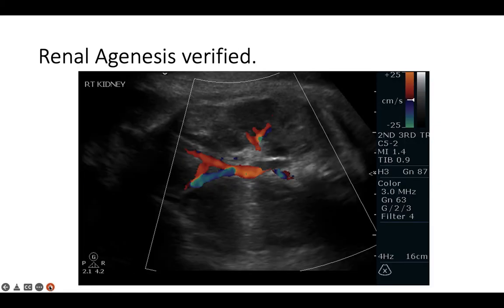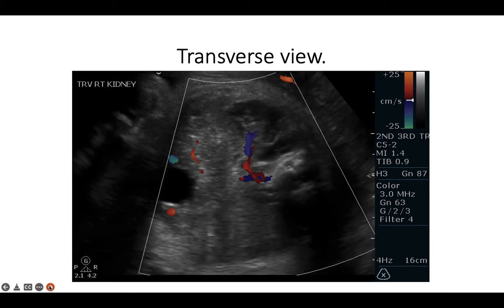Using this technique, you can see there's only one renal artery branching from the aorta in this image, raising the suspicion of renal agenesis. Here it is in transverse, but be very careful when you're in this view. As you can see, the spine will sometimes shadow, making the diagnosis harder, which is why I prefer the coronal view.